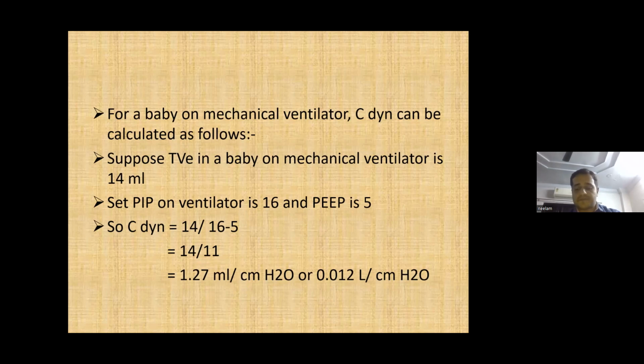Okay, I'll show you the normal values of compliance later. So this actually indicates a low compliance because the pressure requirement is high and the expiratory tidal volume is a little bit on the lower side. So in that case, it indicates the compliance is a little bit less, right?